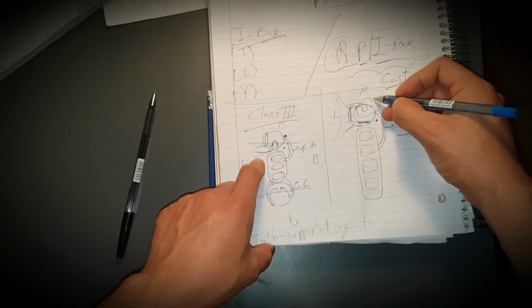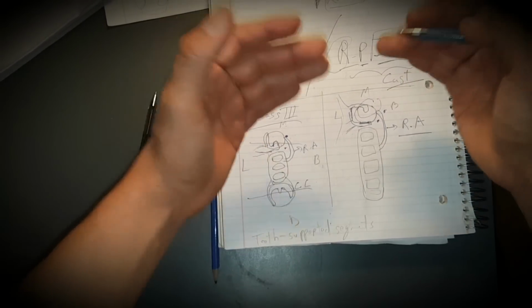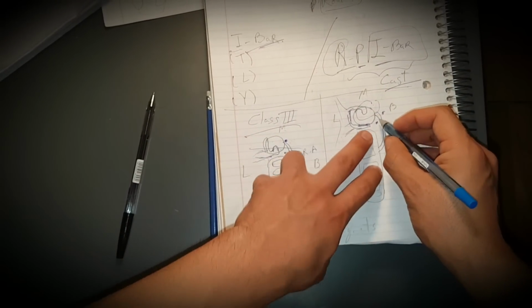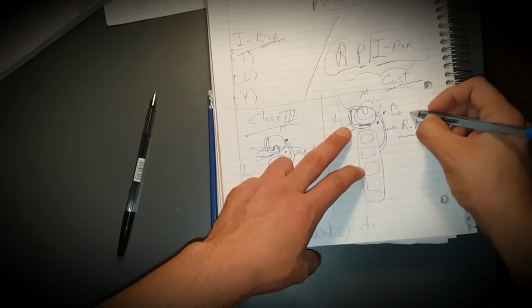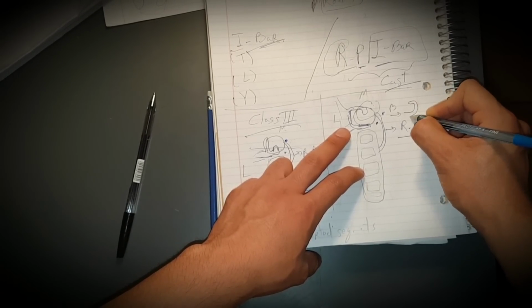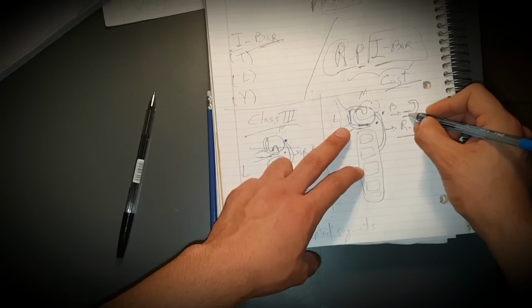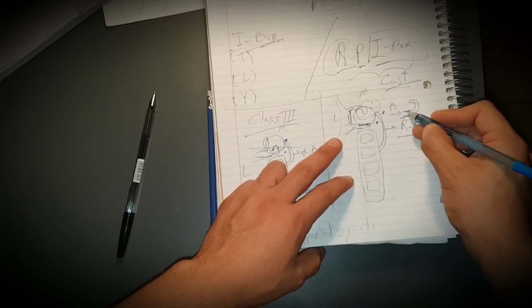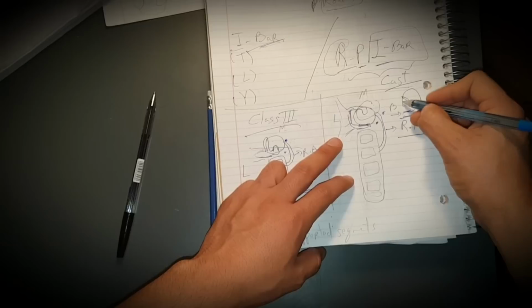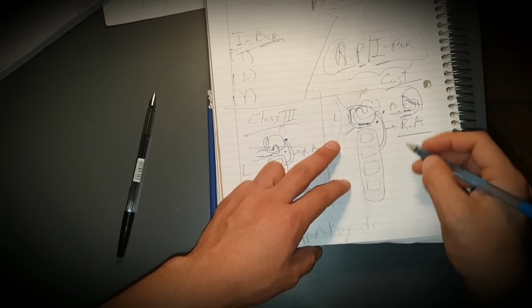In some cases, a little bit of the mesial, but usually mid buccal and distal buccal. To reach the distal buccal, we will have to do a modification, which would be an L bar or a modified T bar, which comes like this for the tooth to engage in this distal portion.